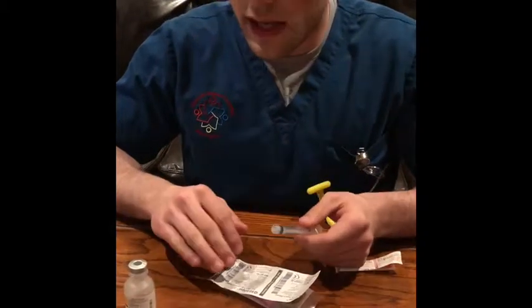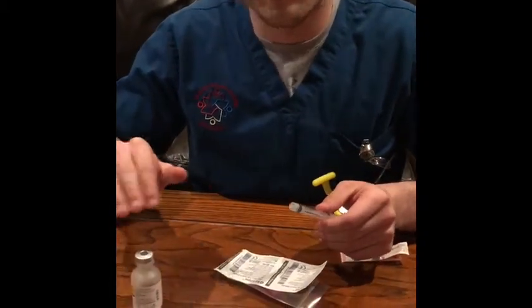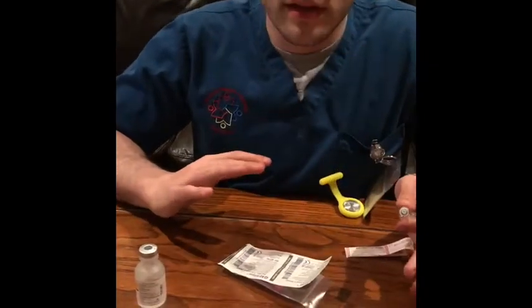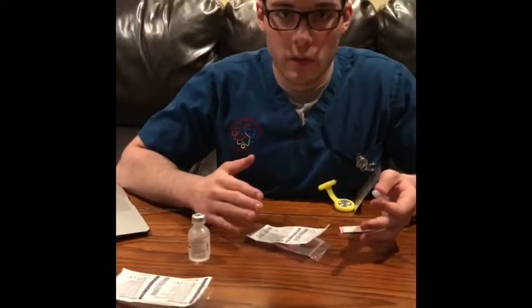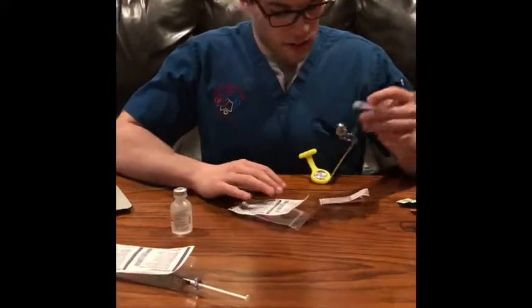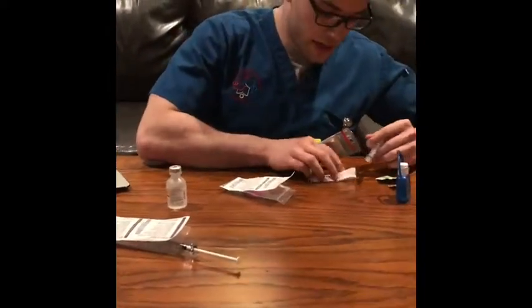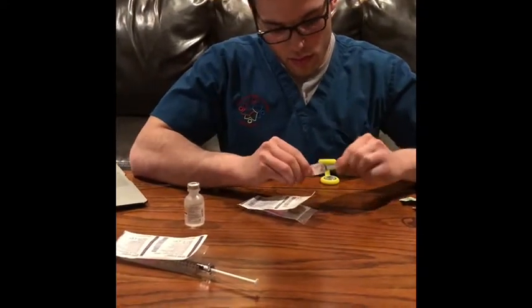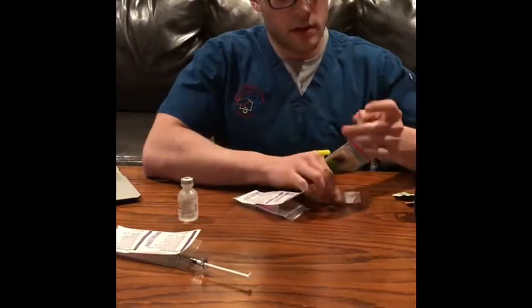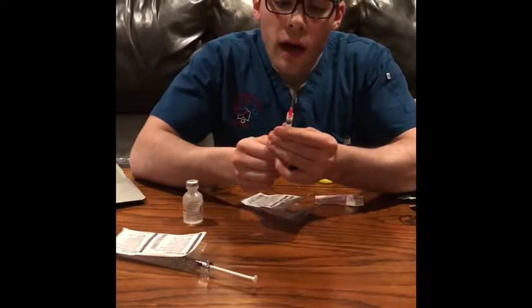And then once again with the medications, I would clean the top, and if I was in and out of the room between preparing medications, I would do, once again, hand hygiene. So now once again, to draw our medications, I will be placing the filtration needle, and drawing back half a milliliter.